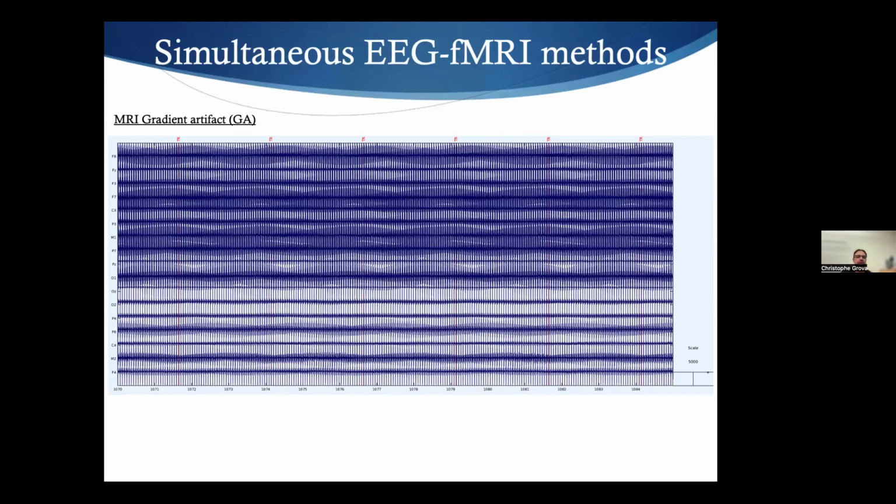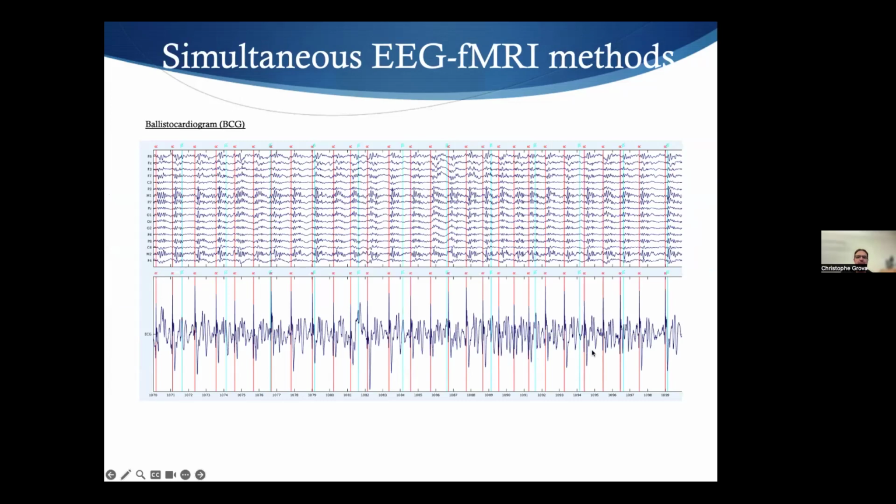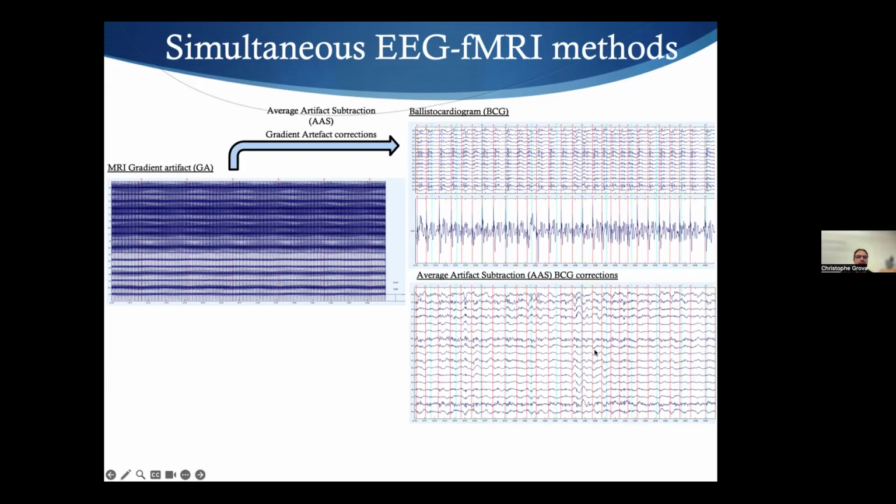And so you have, again, your MRI gradient artifact, which you removed by AAS, and you get this. You see here your ballistocardiogram, and you see here our EKG. Not the best EKG ever, but this is typically what you might get in the scanner, depending on how you install your electrodes. And so you see an example here. You can try to remove the ballistocardiogram using also the AAS method, by just averaging. So it works somehow okay.